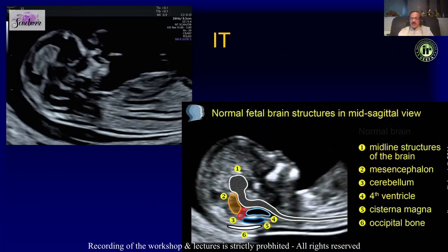The most important structure is the intracranial translucency (IT). In the same NT sagittal section, you can see three sonolucent areas: the first is the brainstem, the second is the IT which is the fourth ventricle, and the third is the cisterna magna. Between these three black spaces are white lines — the brainstem, the roof of the fourth ventricle, the choroid plexus, and the occipital bone.